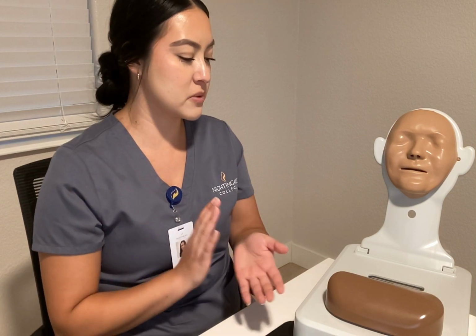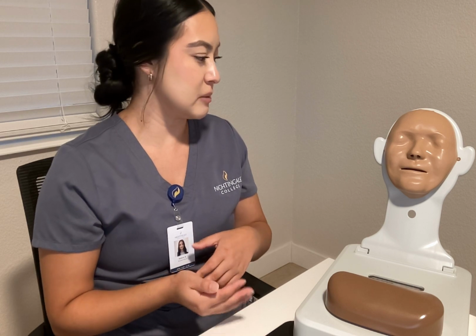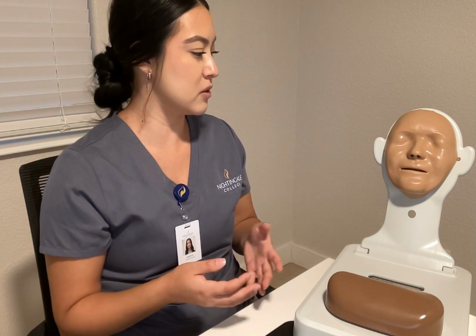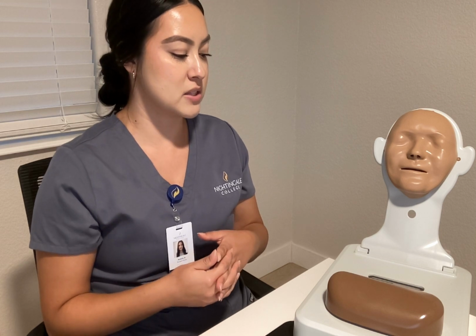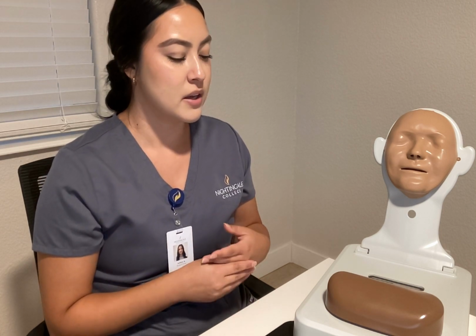Mr. Smith, we're going to be doing this on your forearm today. With injecting the TB test, you are going to get a small wheal, or it may look like a mosquito bite to you. That is what we are looking for when we are administering this medication. This means that we had successfully injected into the right area.